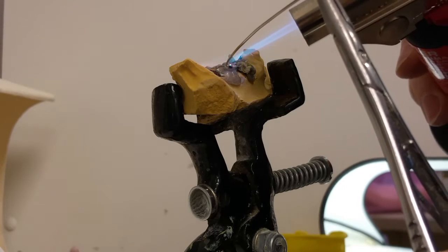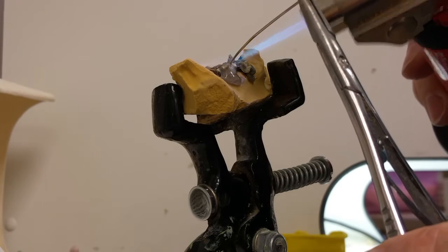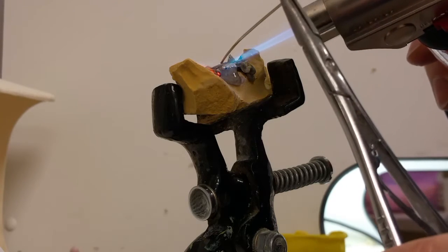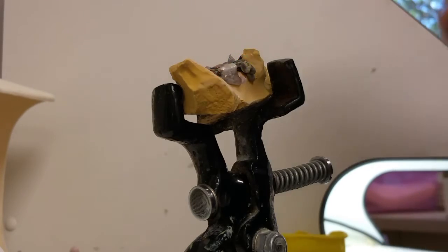I apply the solder about when the flux turns clear. When the solder goes on, it kind of is in a little ball. The more heat I apply, the more it relaxes. You'll see I lift the torch off sometimes when I think it's getting too hot.